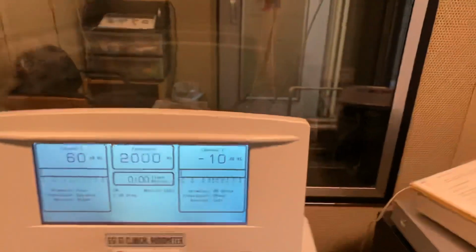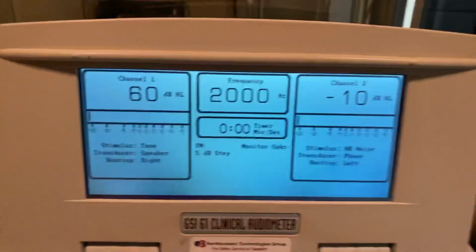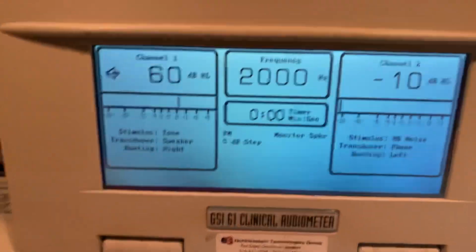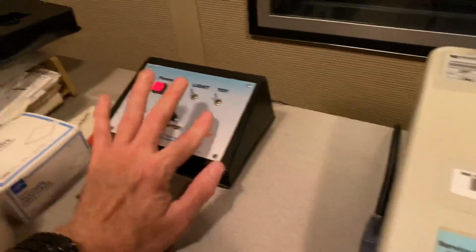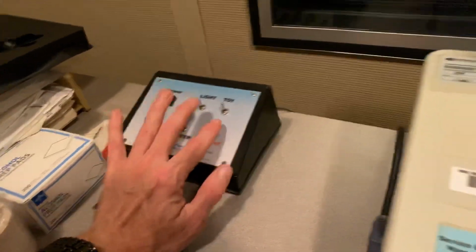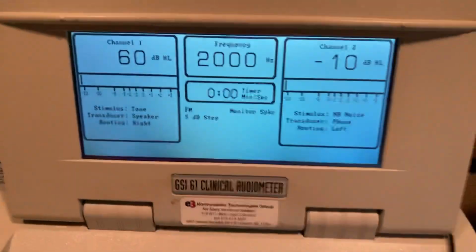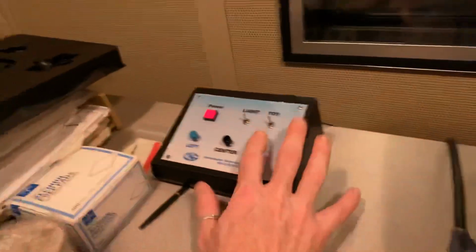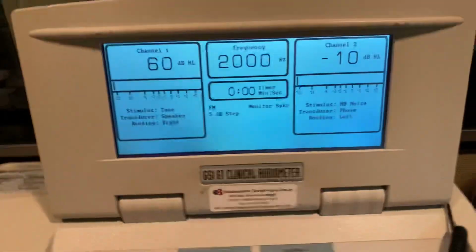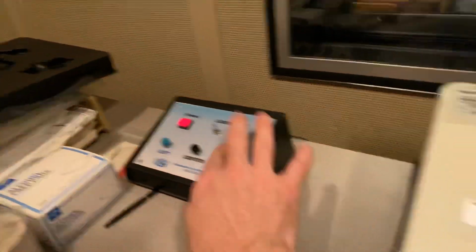We keep doing that, hoping that the child will turn and look at the sound. We will then present the sound, wait for the child to turn, and then present the reward. This is really not that different from Pavlov's dog and classical conditioning, where we are conditioning the baby to turn to what they think is the toy, but really they're turning for the sound in anticipation of the toy, okay?